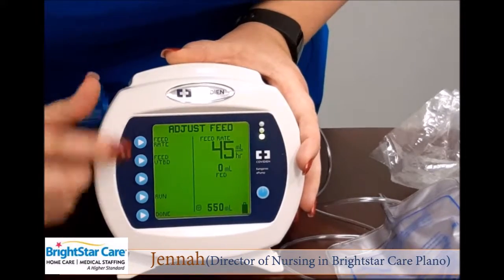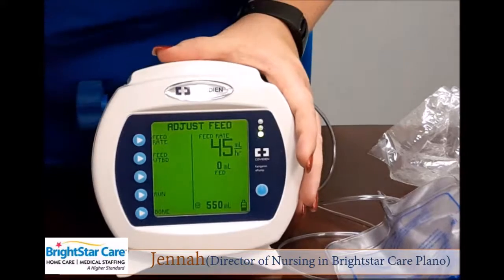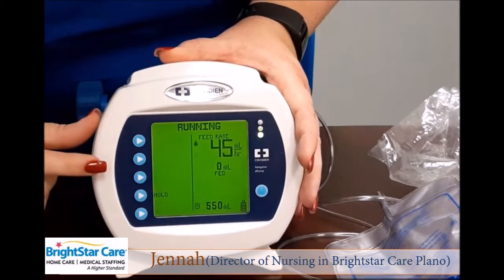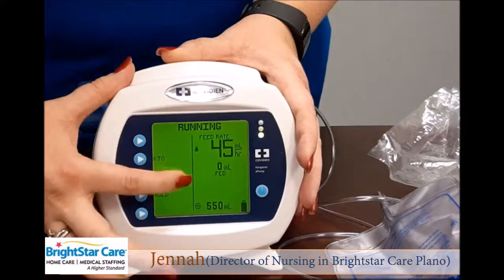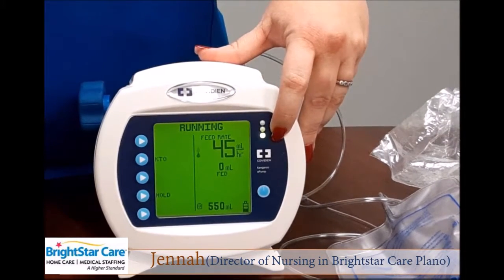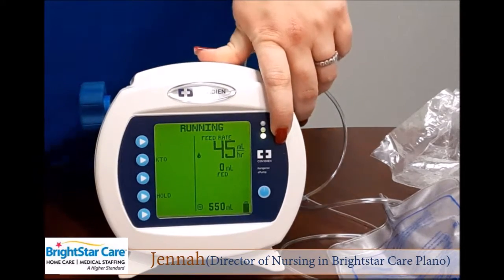At this point in time, provided I have primed my pump and attached my patient, I can select run. When I select run, I'm going to get a message that my pump is running, and I'm also going to have a drip that's dripping down my screen, and I'm going to have a green indicator light. These things let me know that my pump is indeed infusing tube feed into my patient.